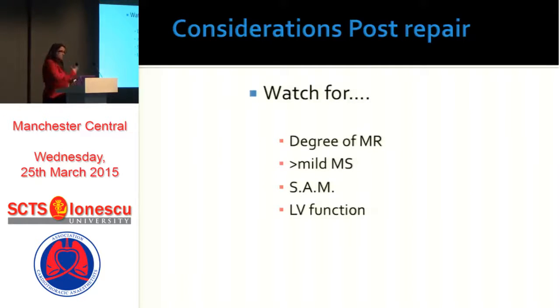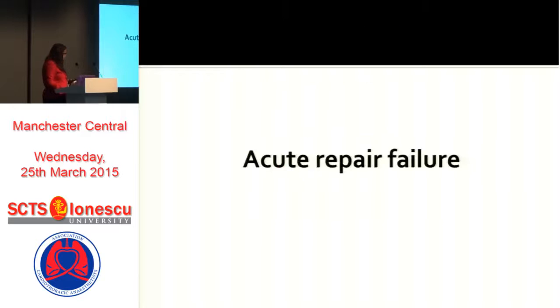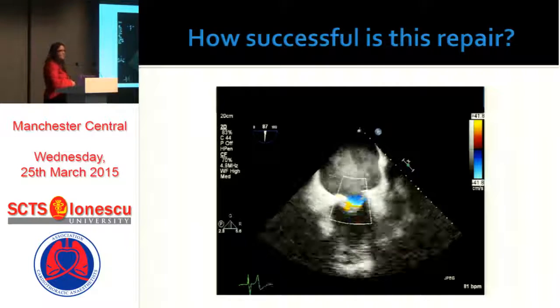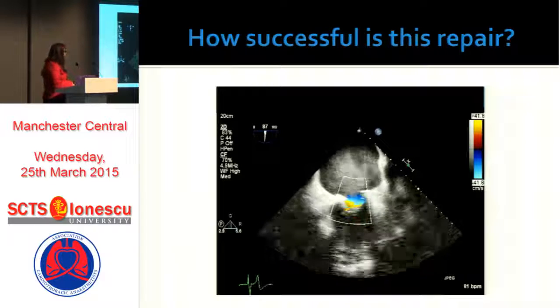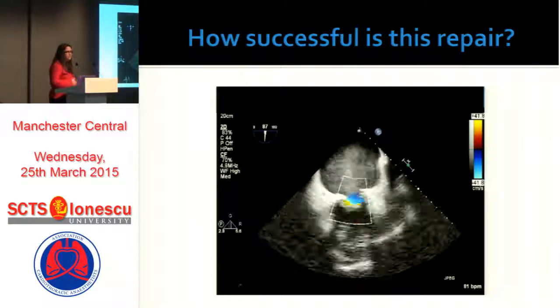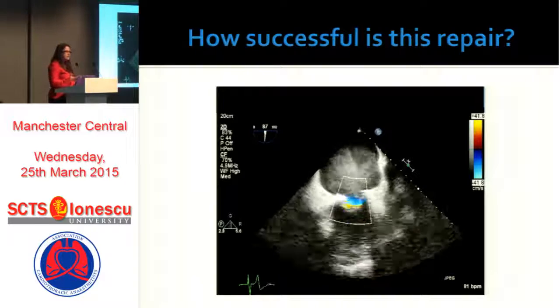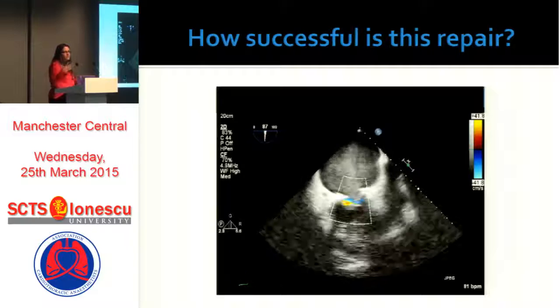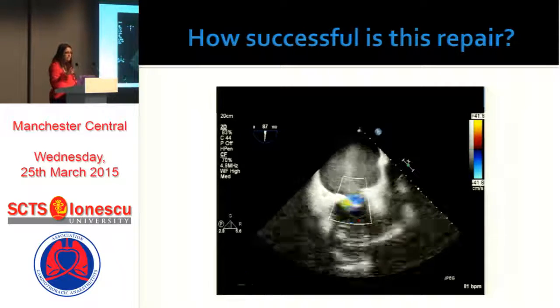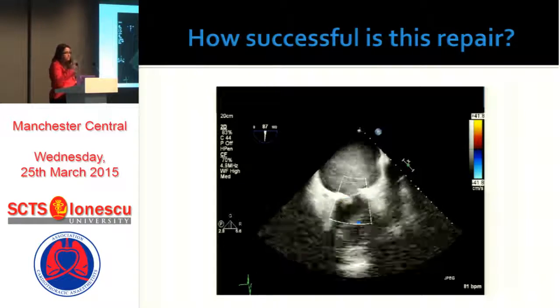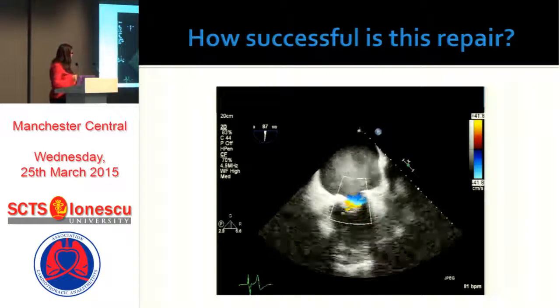Back in the operating room — the surgeon has repaired a valve. Looking at some pictures: in this particular case, the repair is too successful — this is mitral stenosis. The standard guidelines state this must be patient-specific, but in general, a mitral valve area bigger than 1.5 cm² should be allowed, or a mean gradient of less than 5 mmHg.